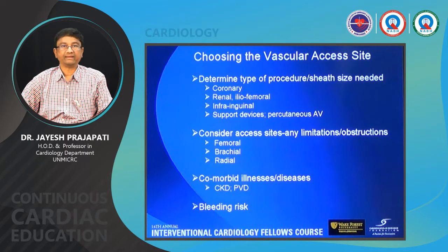Previously people were thinking that radial access carries more risk of embolization and stroke, but not so. For the aged patient nowadays, because the femoral or iliac aorta is too tortuous, and they cannot lie down because of back problems and urination problems and immobilization related issues, radial is preferable for them also.